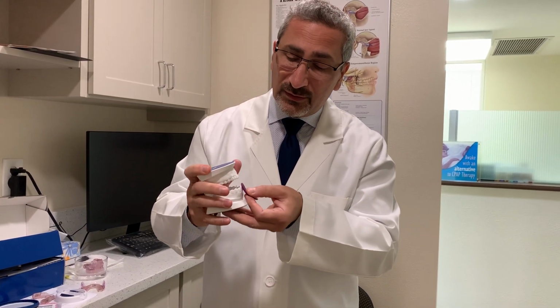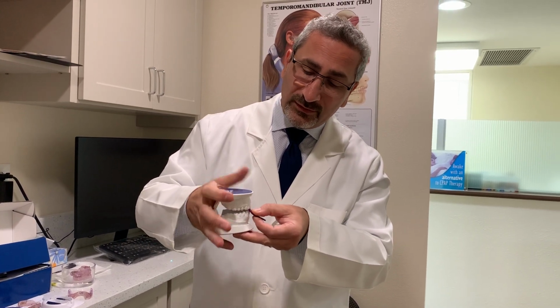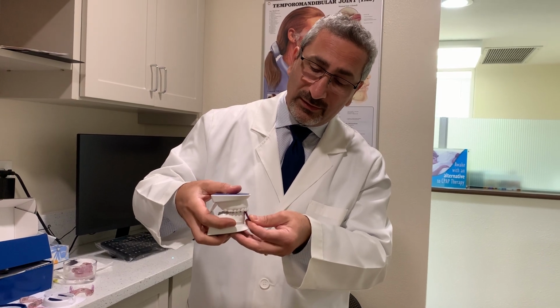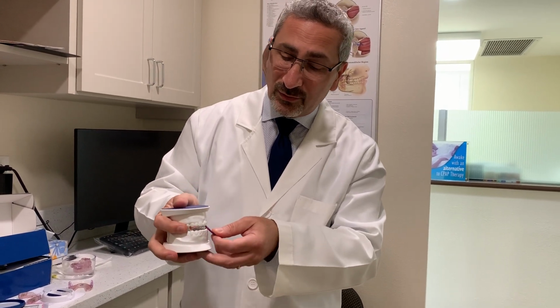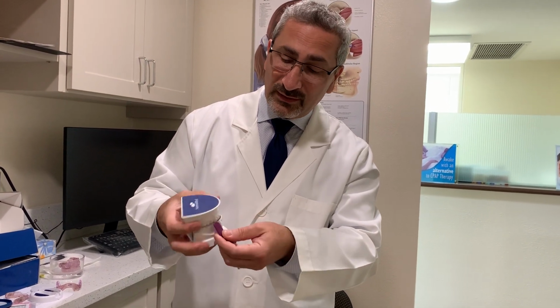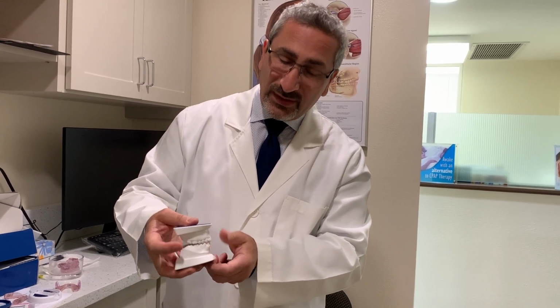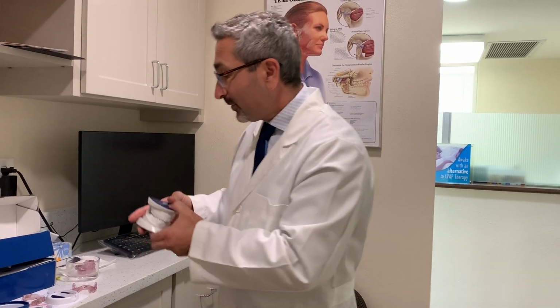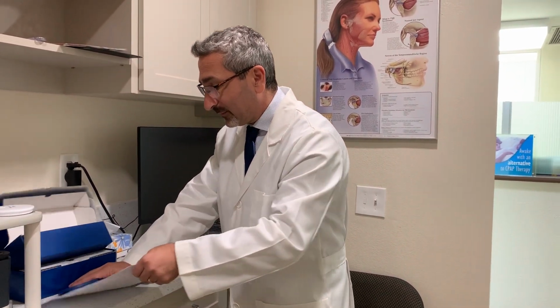So what we do is, you're gonna use this rubber piece, you're gonna fit it in there, and you're gonna bite, and you can see how it's pulling the jaw forward as I angle it upwards. And you're gonna squeeze on that for about 5-10 seconds and repeat that for a couple of minutes. And then you're gonna go to one corner eye tooth and do the same thing, bite and squeeze, relax. Other side, bite and squeeze, trying to get your back teeth to fit together.